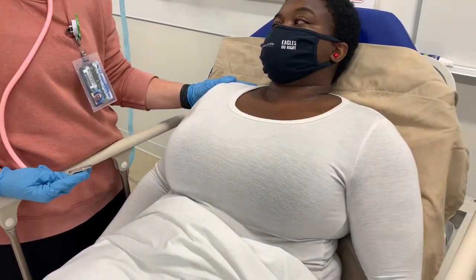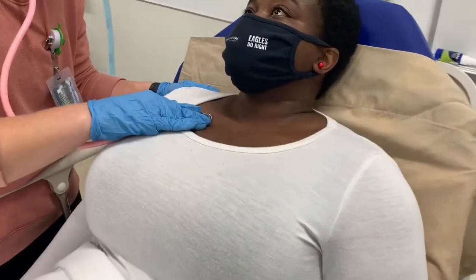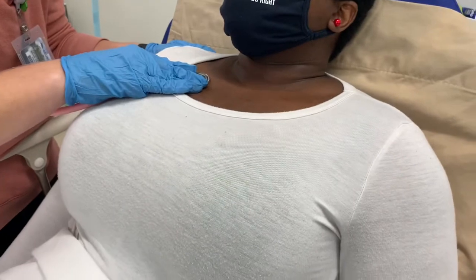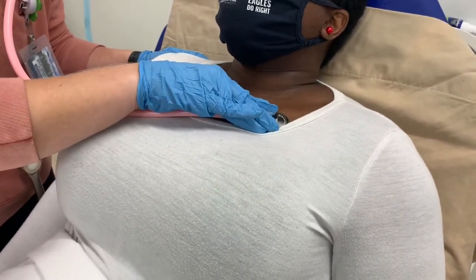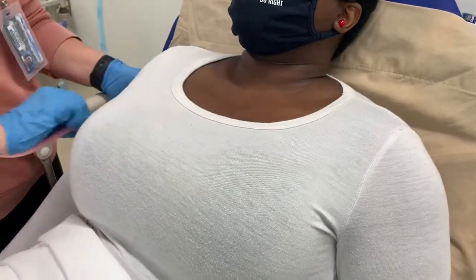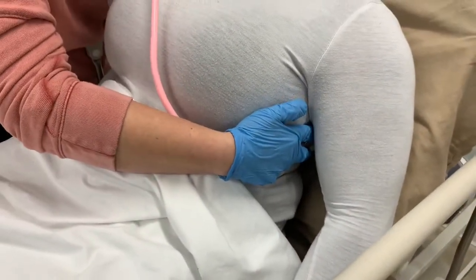Okay, now Miss Eddie, I'm going to listen to you, auscultate the anterior chest bilaterally, okay? You take a deep breath for me. Be sure to use your stethoscope properly. Use a systematic method. We're gonna go left, right, left, whichever order, so you're listening to the same lung field on the right and left, to compare the sound.